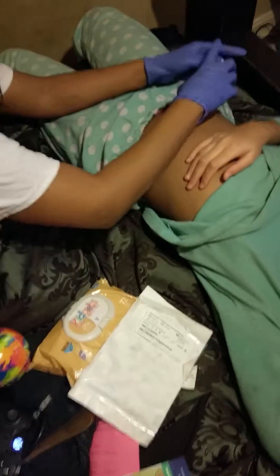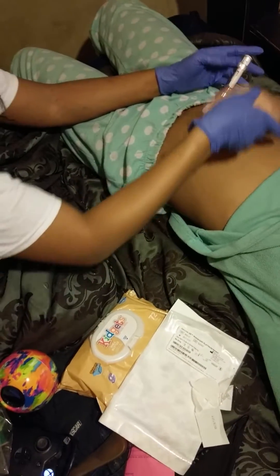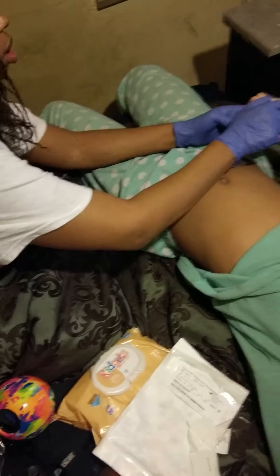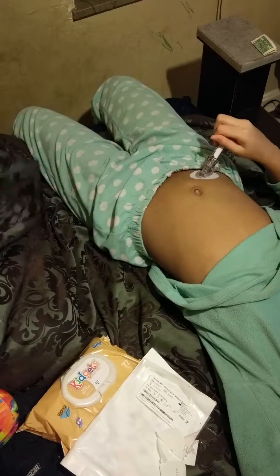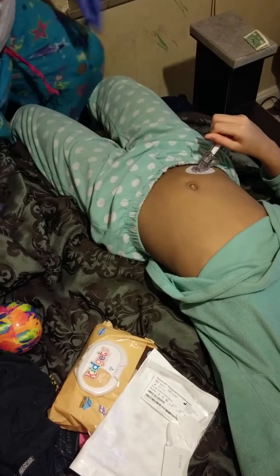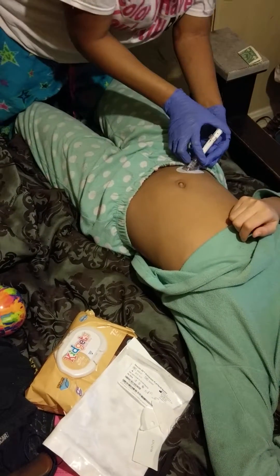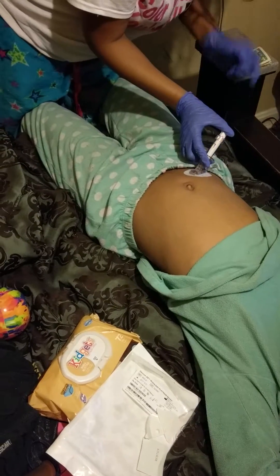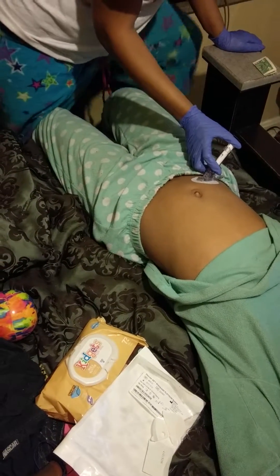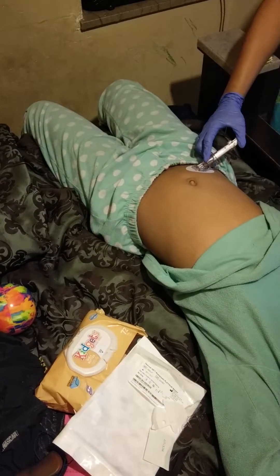Now, on the counter — maybe I should get up. Yeah, maybe you should. Just hold it up. Don't press it, just hold it. Okay. One, two — hold on. Ow. You just press it in.